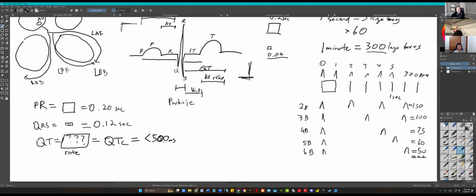This is important for toxicity because of medications that prolong the QT: Zofran or antiemetics, antipsychotics. Zofran's probably the worst of the antiemetics. Methadone, especially. If people are on methadone and you start giving them antipsychotics, you can put them into torsades. So this needs to be less than 500. Generally, as long as it's less than 500, I give whatever I want. If it's over 500, I start being cautious.